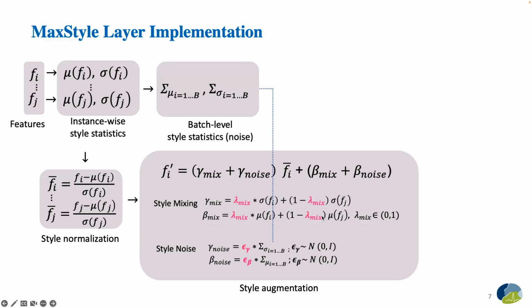To further enhance the hardness of the augmented styles, we apply the adversarial training technique to search for the optimum combination of style augmentation parameters highlighted in pink. Specifically, those values are optimized in the direction of maximizing the segmentation loss.